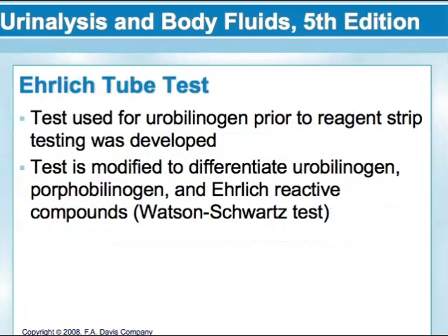Okay, the Ehrlich tube test. The 6th edition, which I think you guys are on the 7th edition of the book, does not talk about these tests, and if the 6th edition doesn't talk about it, the 7th probably doesn't either. So it doesn't talk about the tests at all, so we're only going to learn the most very basic information.